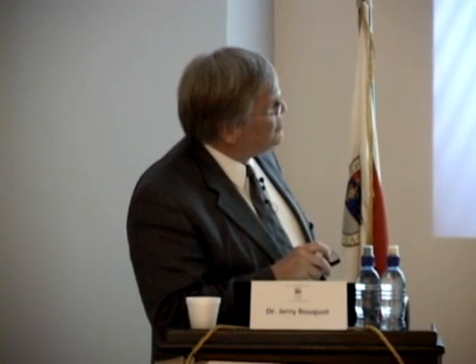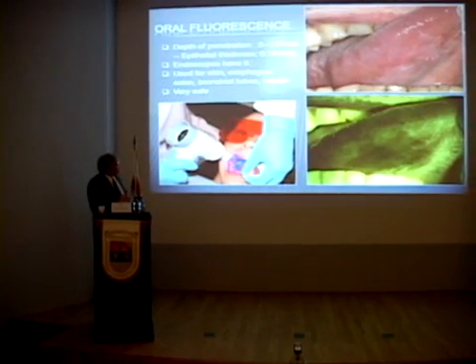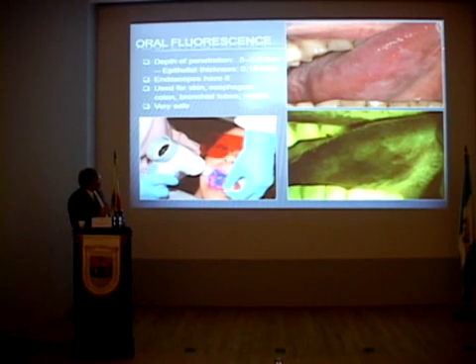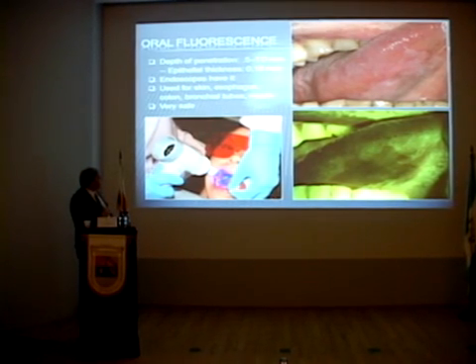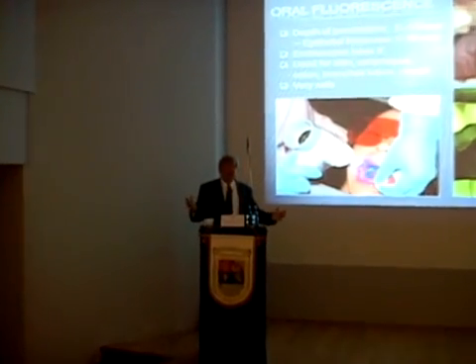This is another study. This came out of the University of Washington, I think, or maybe this is in MD Anderson. But there's what I would have called mild or thin leukoplakia, except that I'd be a little concerned that there are areas of increased whiteness, whereas thin leukoplakia should be fairly uniform in color change. And this is what it looks like with the Velscope. And this whole area, this was biopsied in 7 different places, and every place had at least mild dysplasia. Some of them were severe dysplasia. This test is now routine in a lot of endoscopic products for the GI, for the lungs, for the bladder, for lots of different things in medicine.